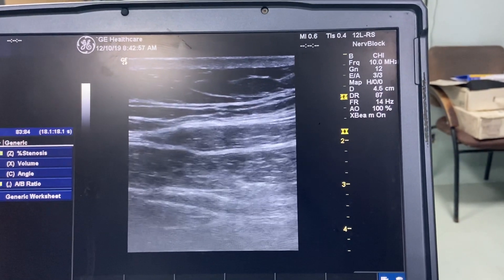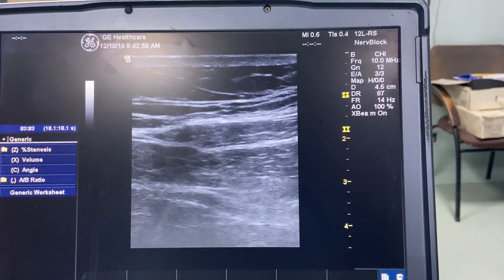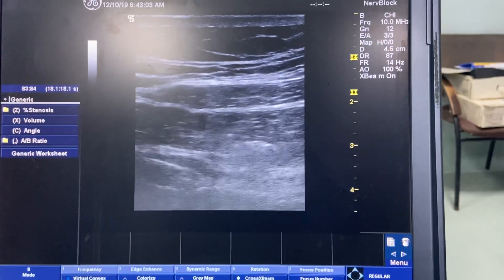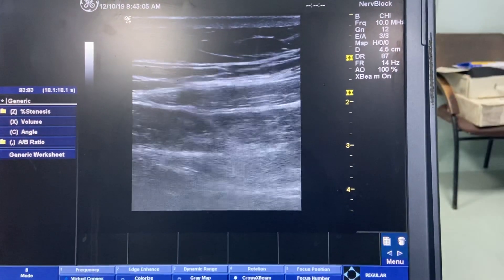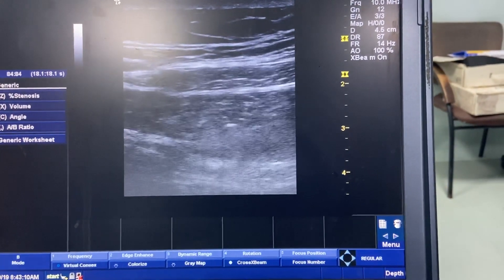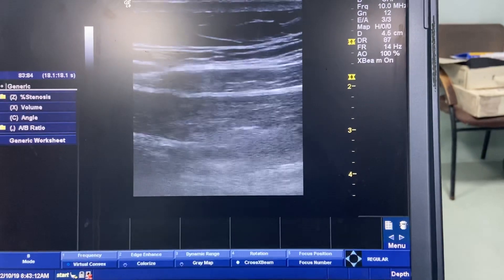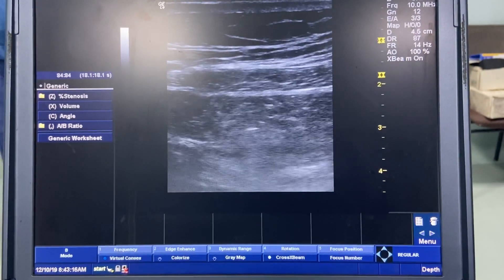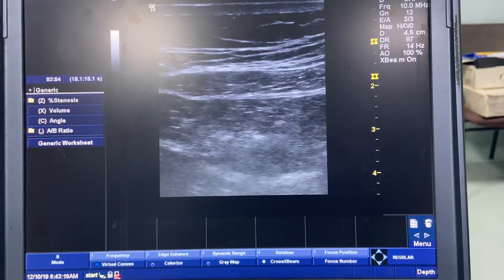Now we will again inject the drug. Here you can see the drug spread. Because of some air there is poor visibility, but once some drug is injected you will be able to see the drug spread. Here you can see the drug is spreading.